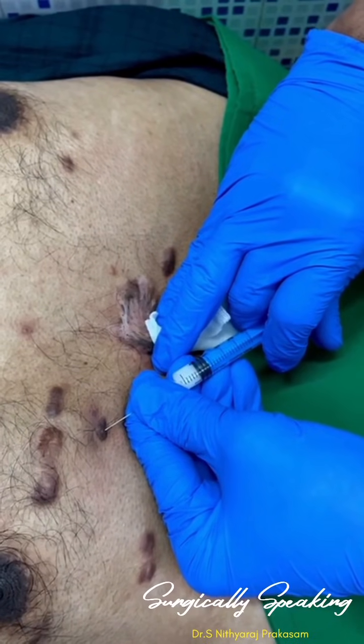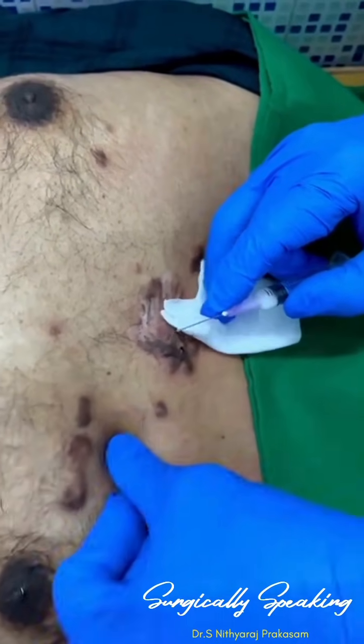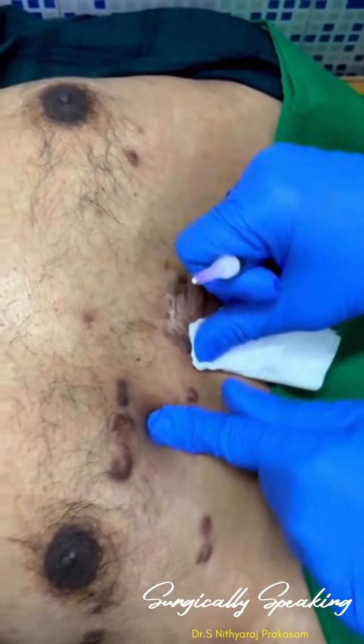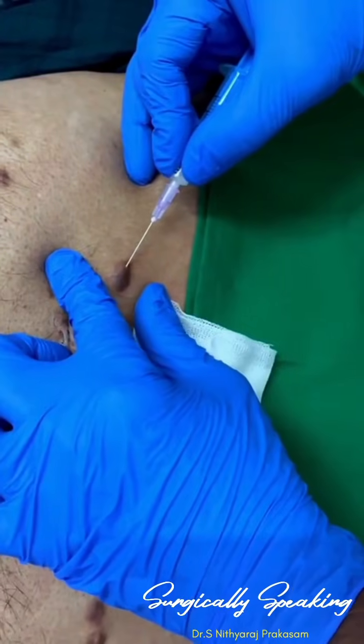Yes, you can see this. My patient here is so comfortable. He is cooperating with me very nicely. But still, you need to be very, very gentle there, right? Constantly keep reassuring the patient.